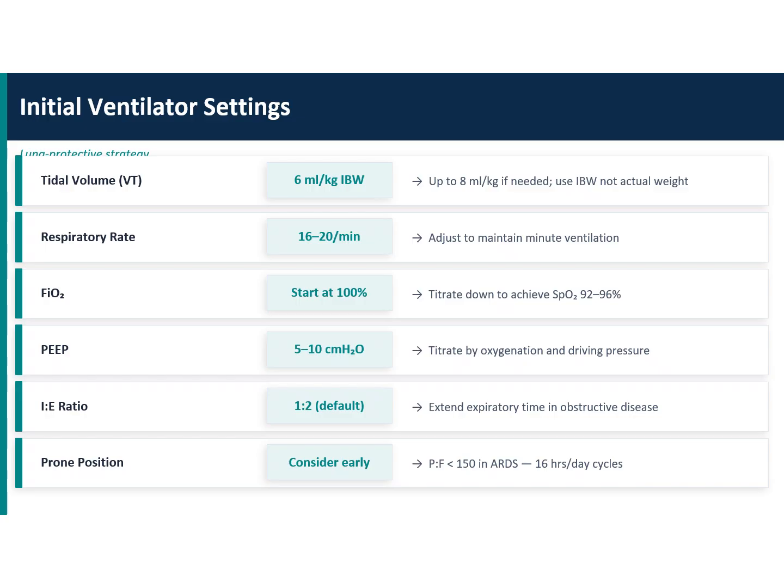So for PEEP also, there are a lot of methods. You can do a lot of stuff to really understand how to adjust the PEEP, but at the bedside, looking into the driving pressures is probably the most scientific, shown to decrease mortality when compared to looking at plateau pressures alone. So that is what we have to do at the bedside. But again, when you're looking into the driving pressures, you should know that the patient should not be having a high respiratory effort. If the patient is taking a deep breath in, the driving pressures will no more reflect transpulmonary pressures. So basically, we are looking at driving pressures as a surrogate for transpulmonary pressures.